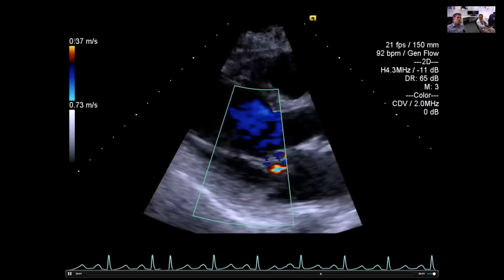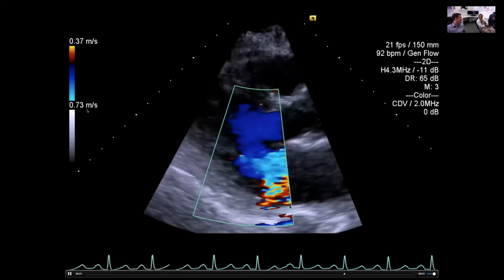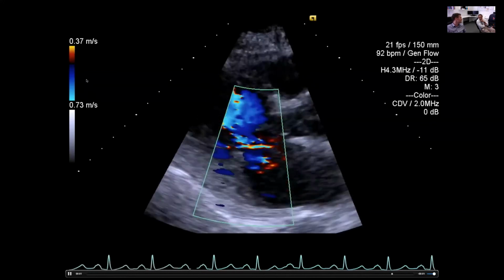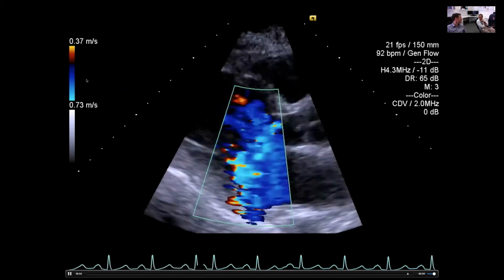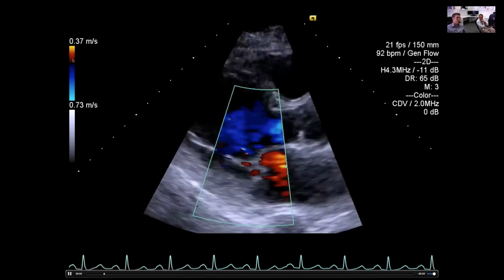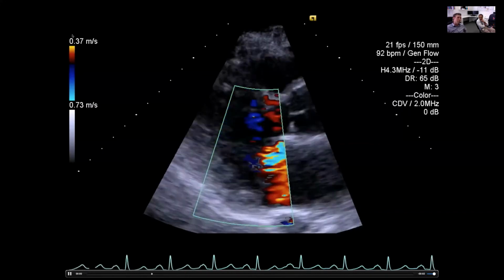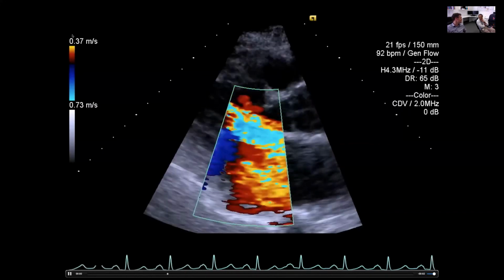But they're different, right? They're normally the same. They should be. So what's happened here? Why is it like this? I think probably part of the setting. Yeah. And why have I done that? So I've moved the baseline up to close to 0.4. Yes. And I do that because on the image before this, I was trying to do a PISA.